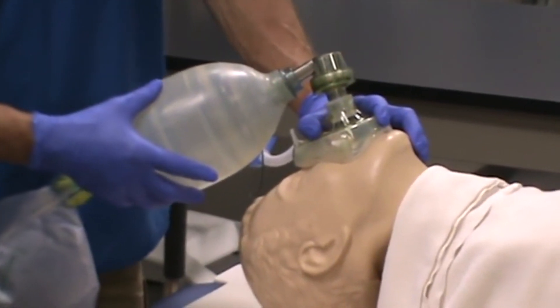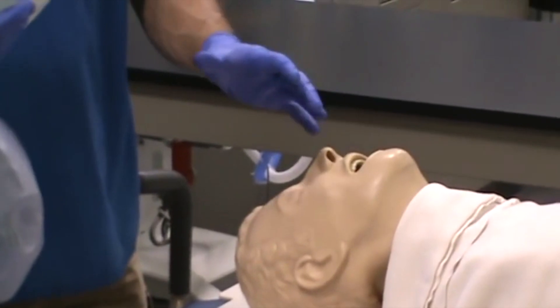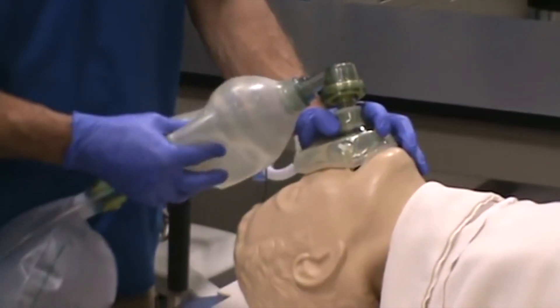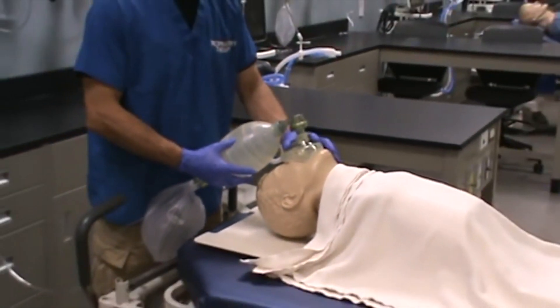What also could be the problem is you don't have a good enough seal between the mask and the patient's face. If that's the issue — you try to ventilate and nothing's going in — simply try to make sure that you've got the mask lined up appropriately.